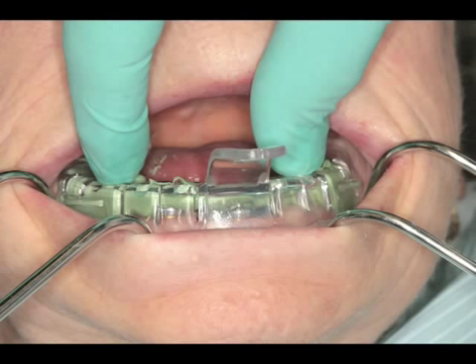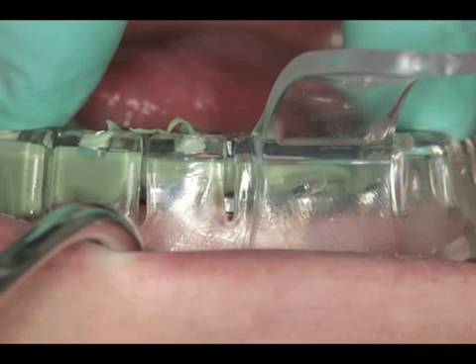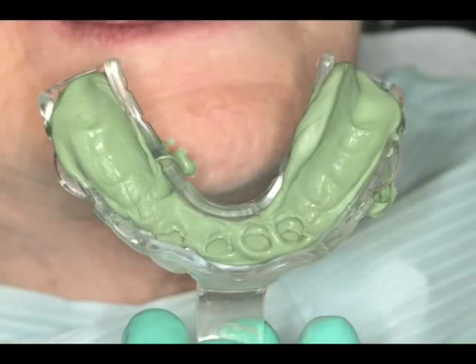You can use retractors to make sure that the impression post does not bump up against the tray and is approximately right in the center of the tray. You can see a little bit better from this angle. We have now placed the tray in and we're letting the stop material solidify. Once it does, we will remove it and analyze it.